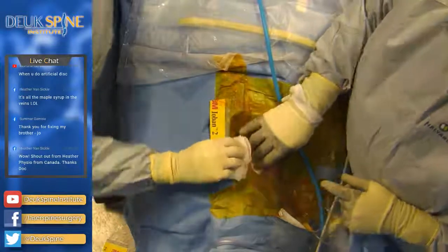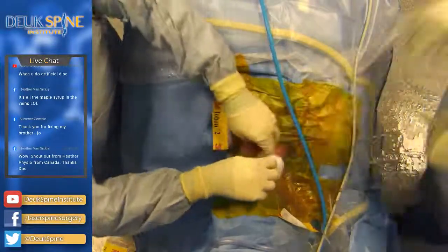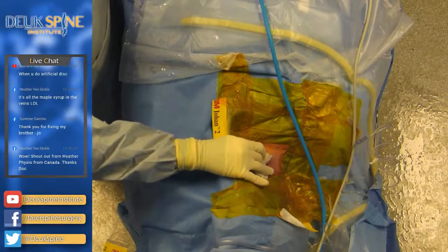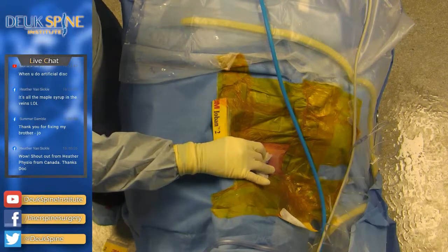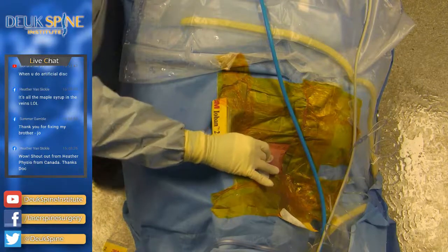It's almost there, almost done. It's just one drop there. I would hold it for another 2 more minutes. Check it out. And then we can put the bandage on, but give it another couple of minutes. So we're done with the surgery. Do we have any questions, Sean? None remaining. All right, ready to take off the field.